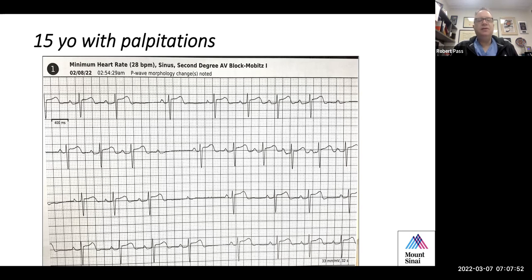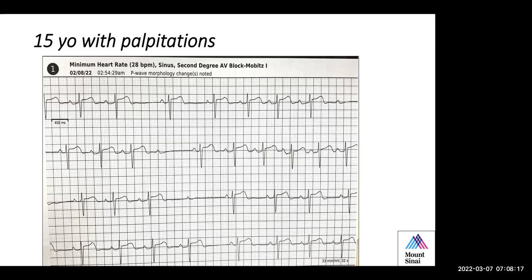So this is a 15-year-old who's complaining of palpitations. This is a recording obtained at almost 3 in the morning. So what do you think, Tarek? Would this concern you, this observation? Would it not? Anything you would do further about this or to evaluate this? Yeah, so I think we'll assess the patient. With the patient complaining of palpitations, probably a small evaluation would be appropriate.